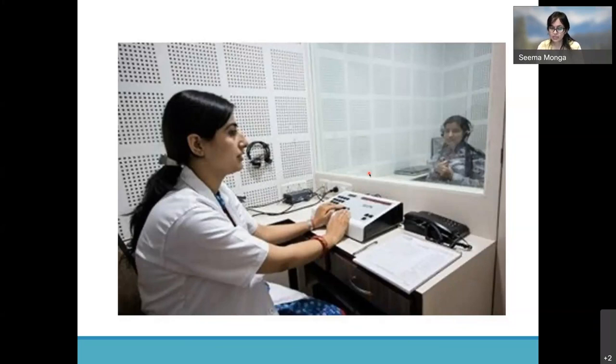How do you familiarize him? Make him put the earphone and tell him, this is the kind of sound that you'll hear, make him hear. And then tell him, whichever side you hear, raise that hand. Suppose you hear right side, you raise that hand. You hear left side, you will raise left hand.